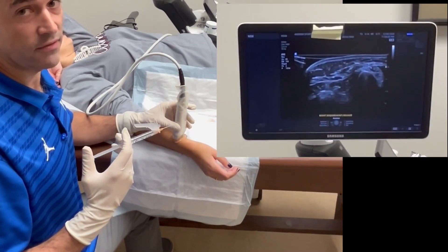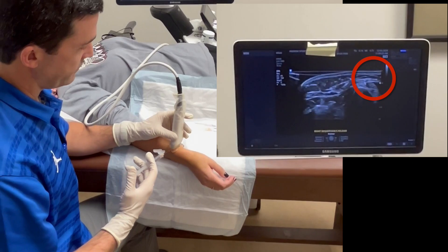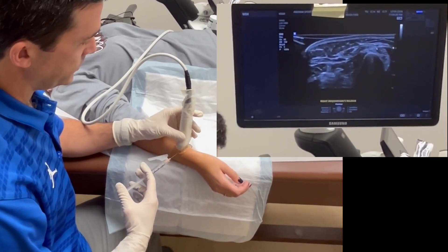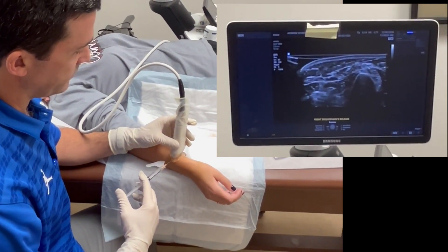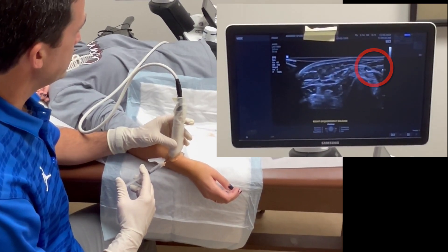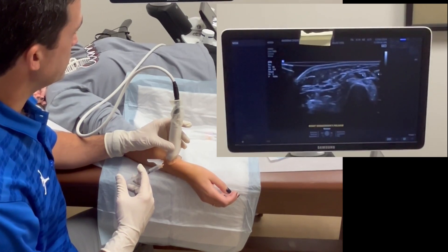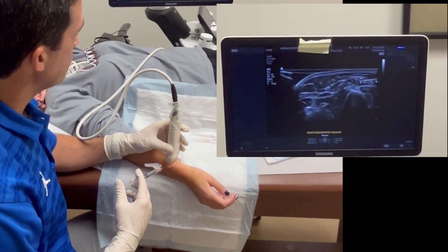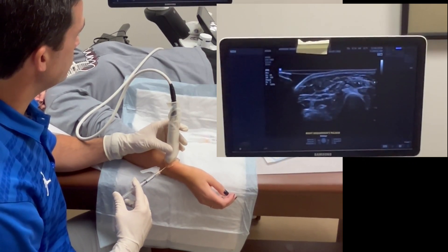We've identified the superficial radial nerve on the screen right where the arrow is, and we'll go ahead and advance our 25-gauge needle in-plane with the probe. I'll inject a little bit of medication subcutaneously so it starts providing some relief. You can see the needle coming in-plane with the probe on the screen, and we'll inject right around that superficial radial nerve, hydro-dissecting it off from the surrounding soft tissue — injecting under and then over.